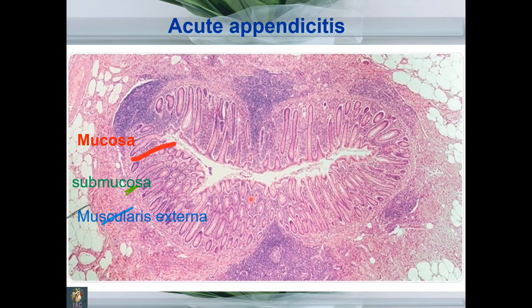Here you can see a beautiful image of appendicular tissue showing mucosa, sub-mucosa, and muscularis externa. You can see bunches of neutrophils infiltrating the mucosa and then into the deeper layers.